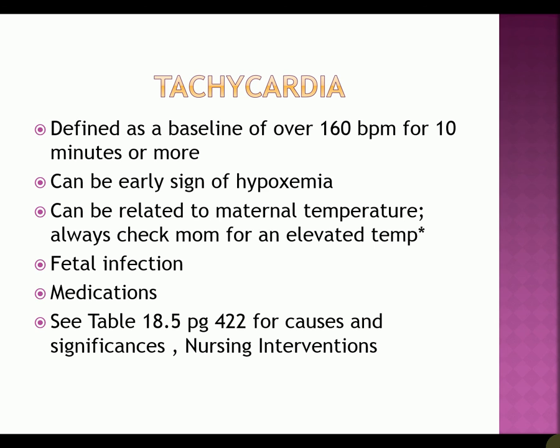So this really goes through and gives you definitions of tachycardia as well as bradycardia, what can cause them and the clinical significance of them. And because it has clinical significance here, and we've been talking about clinical reasoning, look at that and see if that would give you some kind of idea of what we're looking at for clinical significance, what this might mean for us and what we need to be assessing for.